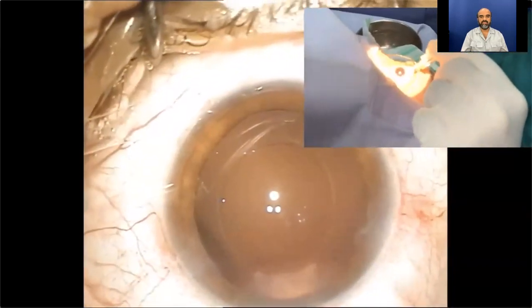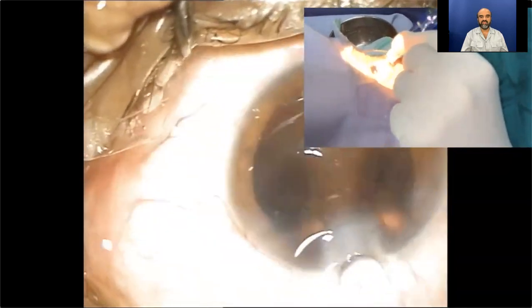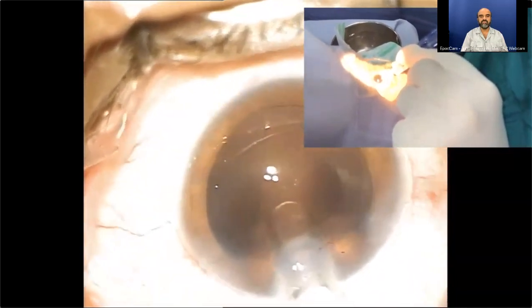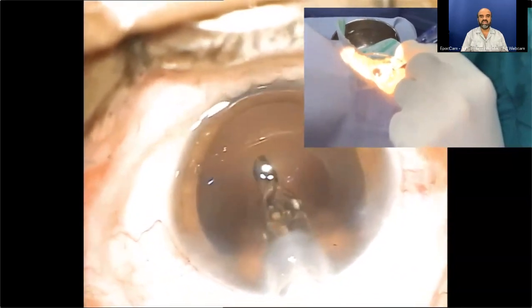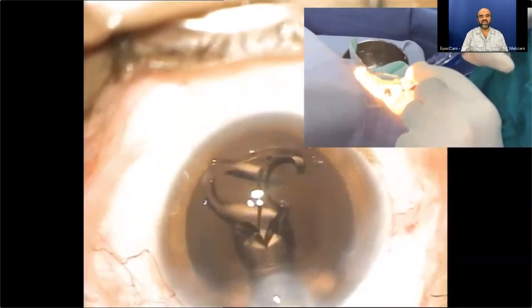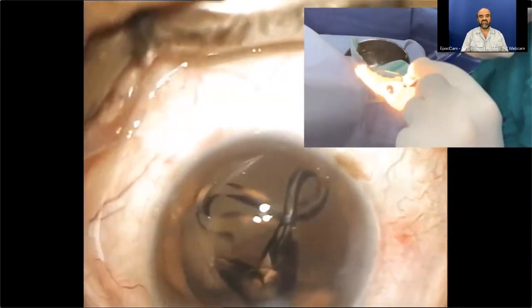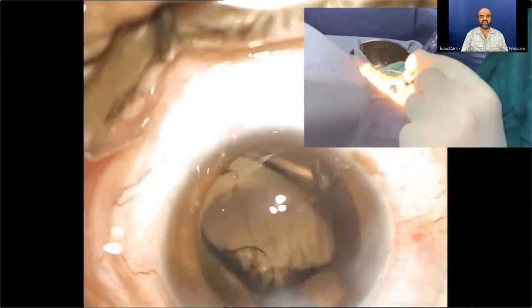Now it's ready. I have used a 3.2 millimeter incision here — it just snugly goes into the eye. A very slow injection process is my priority, and I keep on watching the delivery of the lens till the last minute. As the haptic is opening up, I am very slow in the process, because this lens beautifully centers due to its atypical wider haptic design.